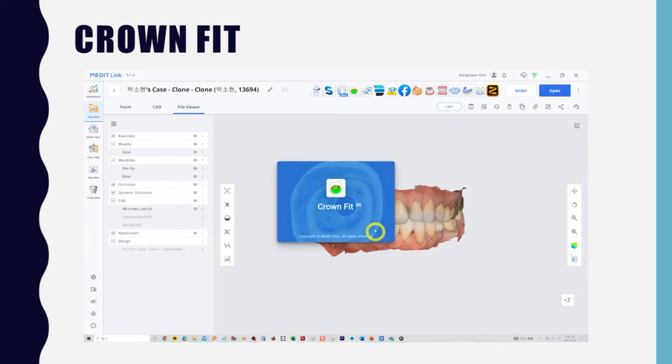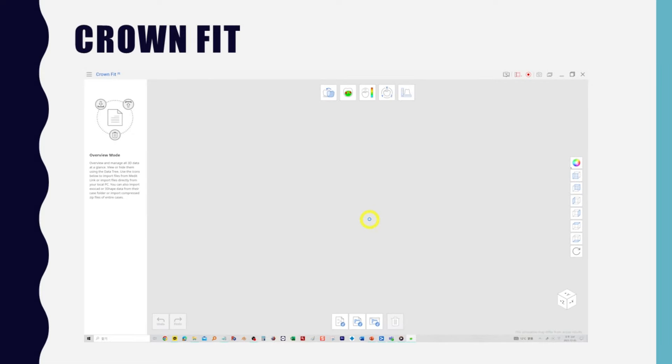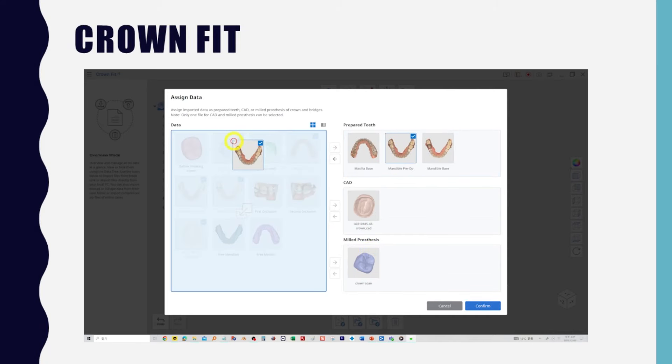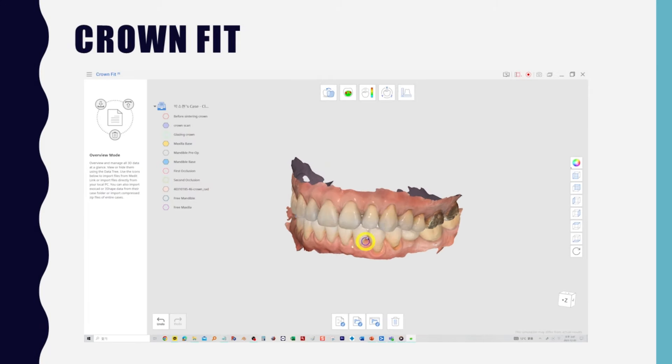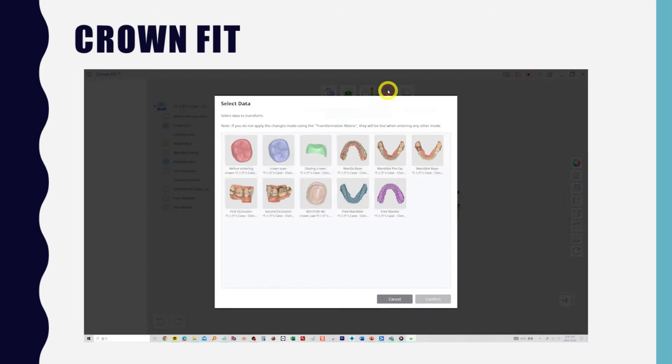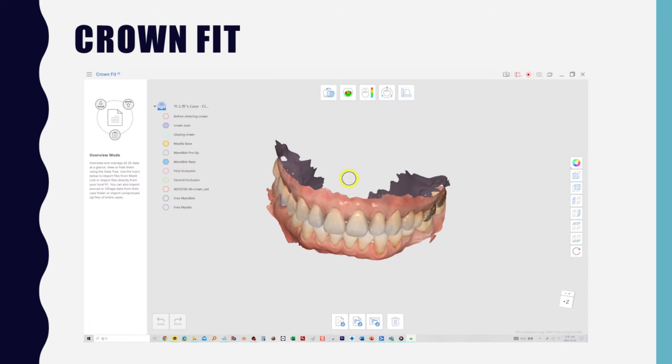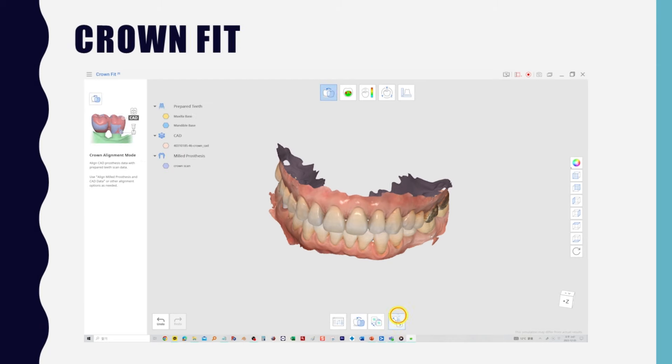The next step is to verify with the Crown Fit app. Place the upper and lower jaw scans, the design file, and the fabricated crown scan file in each location and open them. If you have diagnostic scans, exclude them. If it's a pre-sintered crown, use transform mode to shrink it by the corresponding scale factor.